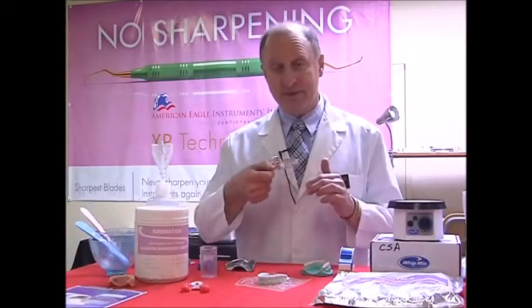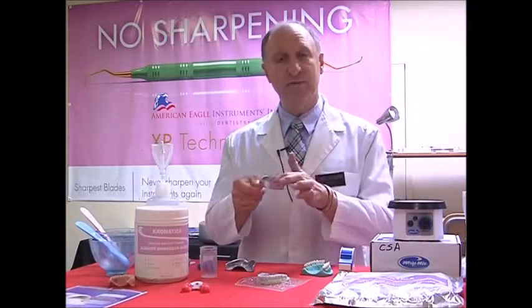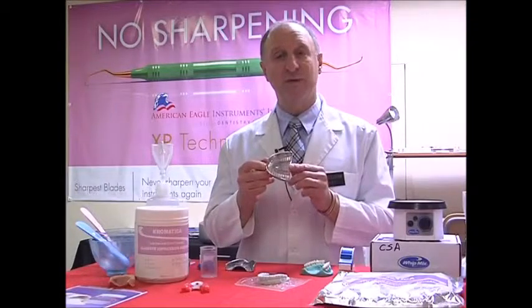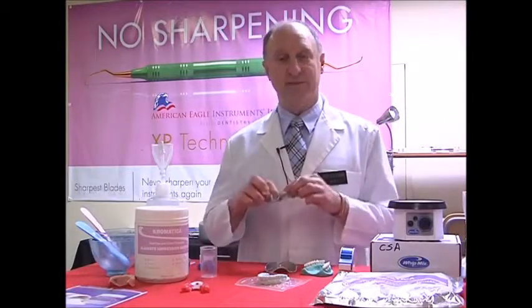They're then put into the mouth, and the material flows through the impression trays. So we lose compression inside here. This is taking what we call a mucostatic impression. Compare that to the solid impression tray.